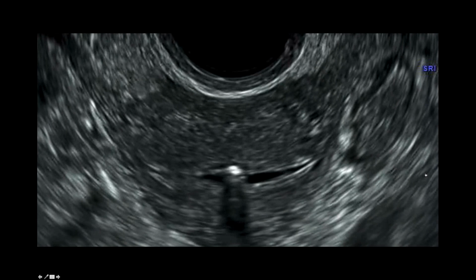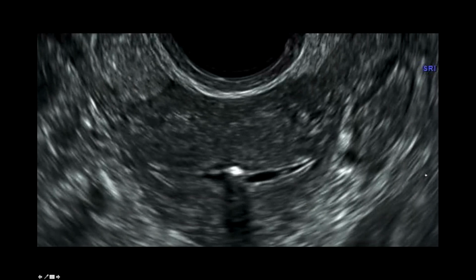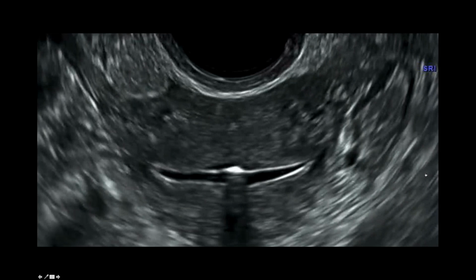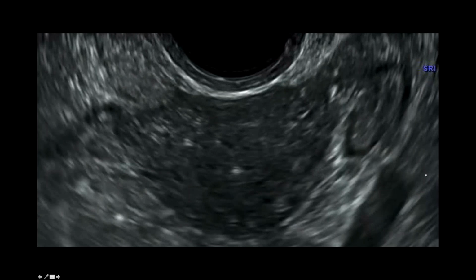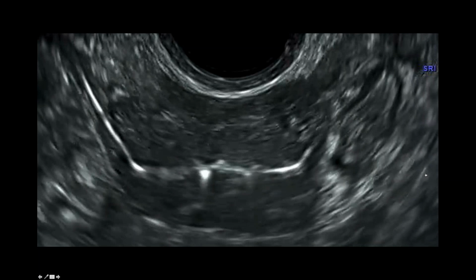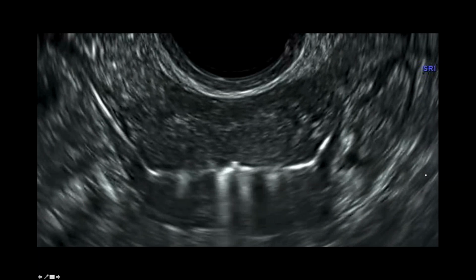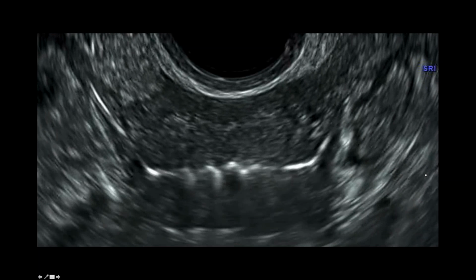Now, you don't need to see the air coming out all the way from the uterus and all the way out to the ovary. Most of the time, we only see a portion of where the air is coming out, because you have bowel obscuring portions of your tube. You may have bowel gas obscuring part of your ovary. So you only need to see the air bubbles somewhere along the course between the uterus and the ovary to know that that tube is open.